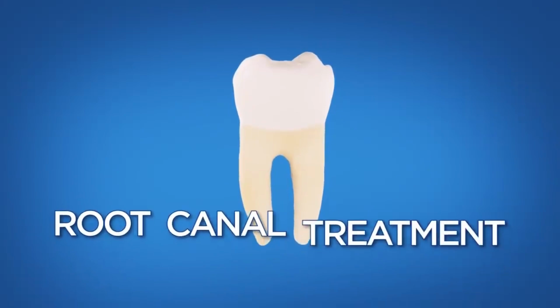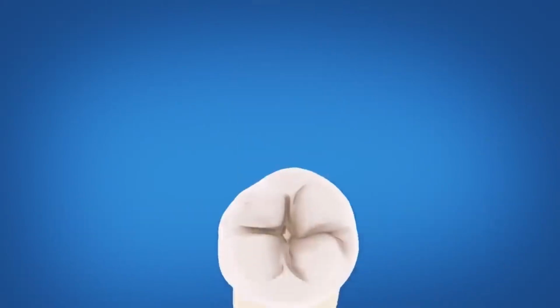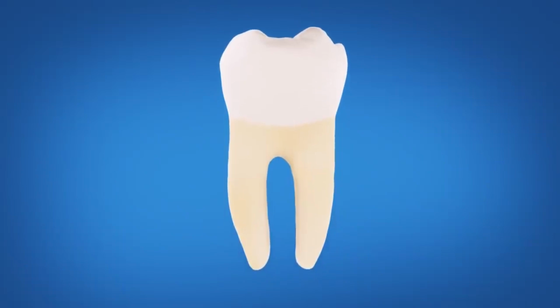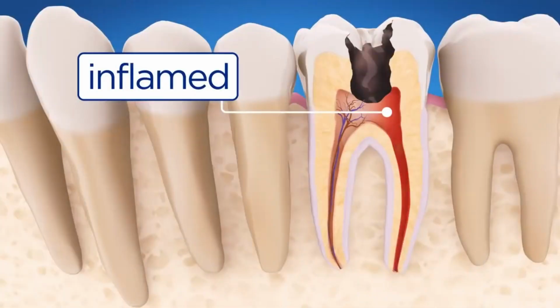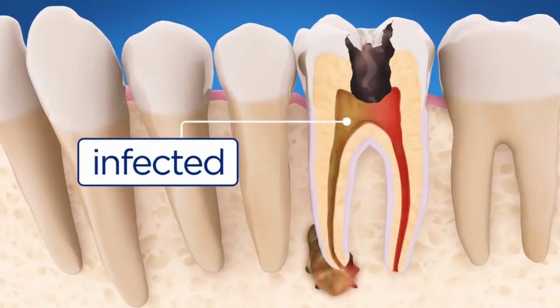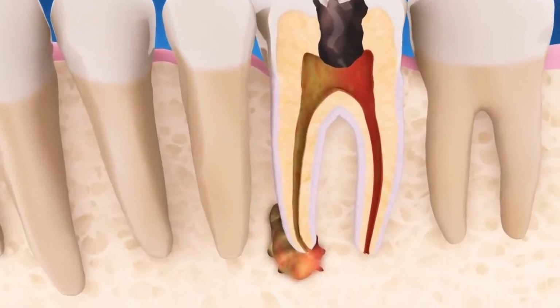Canal treatment, also known as endodontic treatment. Let's take a step-by-step look at a modern root canal procedure. If the pulp becomes inflamed or infected, your endodontist will remove it, relieving your pain or discomfort. Here's how root canal treatment works.